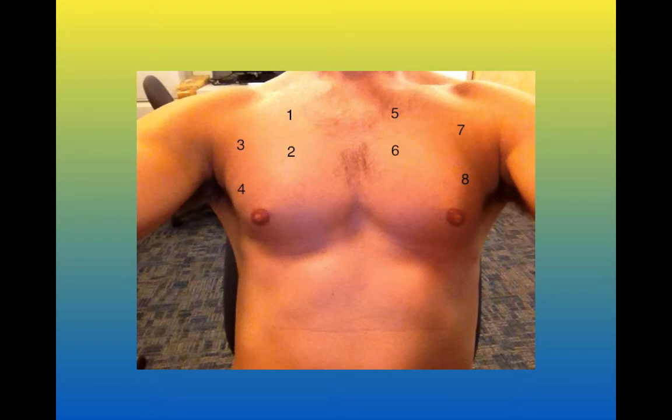the zones of ultrasound here. As you can see, it's hard when you put the probe on the lungs to know where you are scanning. So if you can just throw a number on your image in the text, that really helps us when we look at your images. These are the corresponding zones that have been generally accepted. There are different zoning patterns, but this is the most popular.